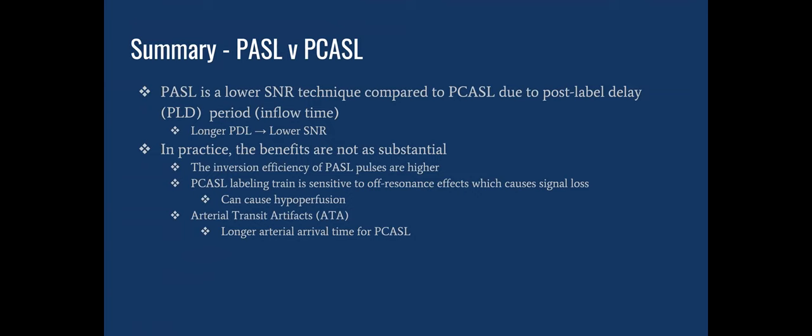In summary, PASL has a lower SNR than the PCASL due to the post-label delay. The longer the delay, the lower the SNR. So in practice, the benefits are not as substantial. The inversion efficiency of PASL pulses is higher, but PCASL labeling is sensitive to off-resonance effects, which causes signal loss and can cause hypoperfusion. And there's also the chance of arterial transit artifacts.